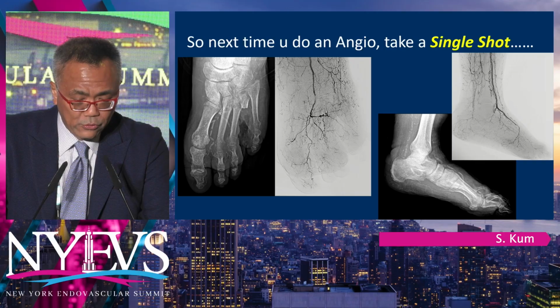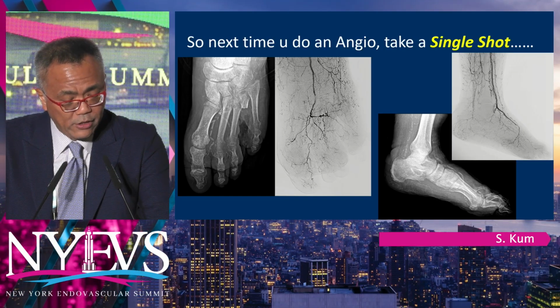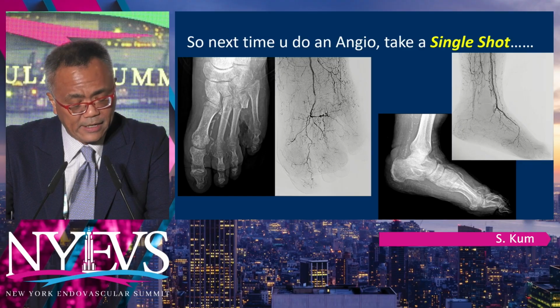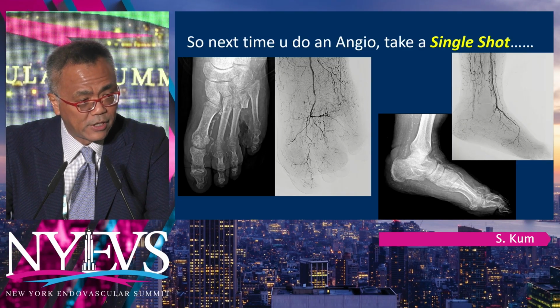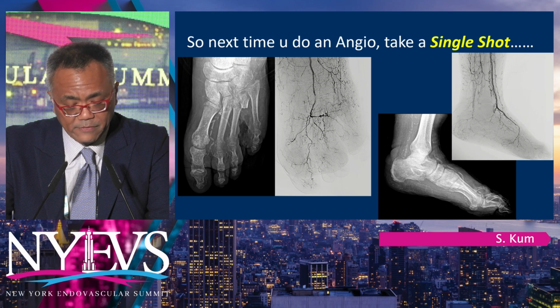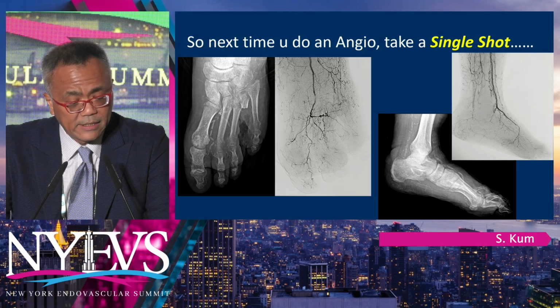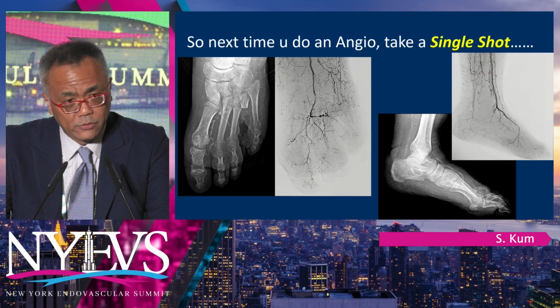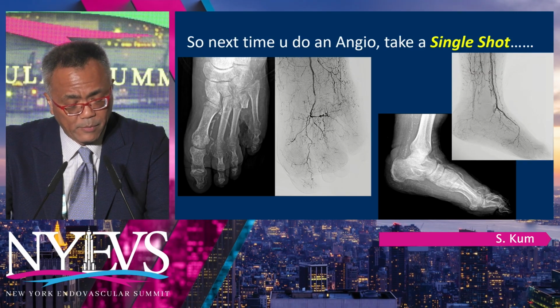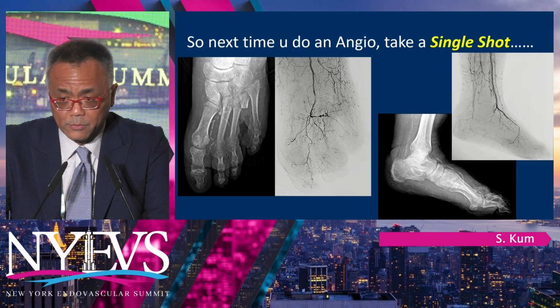So next time you do an angiogram like that, or next time you want to do an angio, take a single shot before you shoot the contrast, even before you get access to the leg. You know you're going to be in for trouble. Call your wife or your husband and say that you're not going to be home for dinner, you're going to be fighting this for a while, and have realistic expectations on what you are going to do for these patients, both from a revascularization point of view as well as a soft tissue point of view.